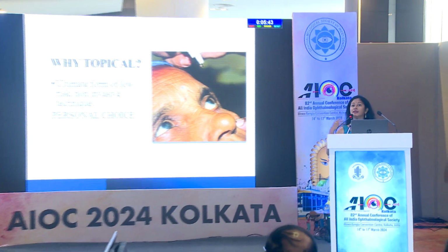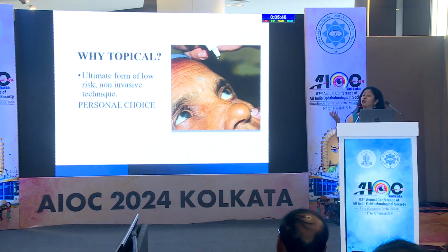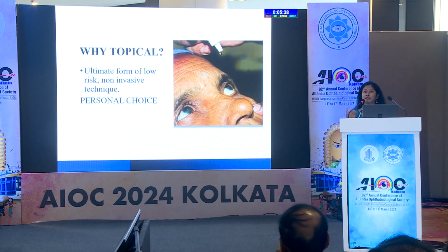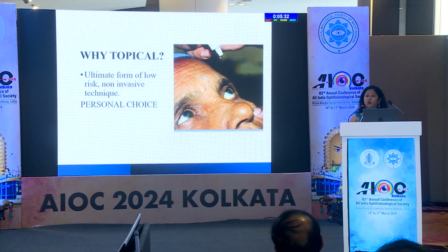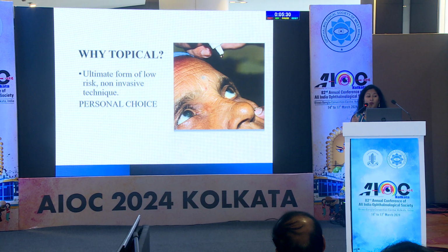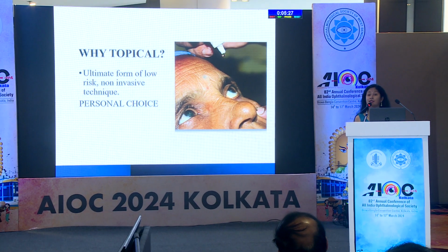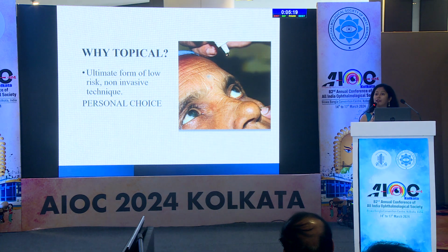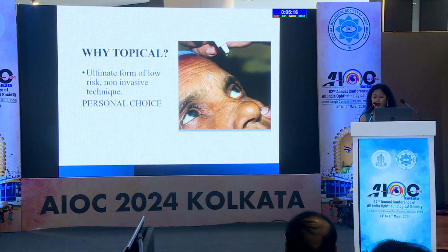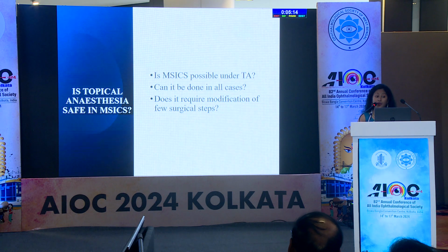Now, why are we talking about topical MSICS? We have been operating on our phaco patients and sending them off without giving the patch nowadays. So even our SICS patients deserve this benefit. We need to see smiling faces in all our patients, not only in our phaco cases. It's the ultimate form of low-risk anesthesia, a non-invasive technique, but ultimately a personal choice. It is the surgeon who decides whether you are confident enough to shift from peribulbar to topical anesthesia.